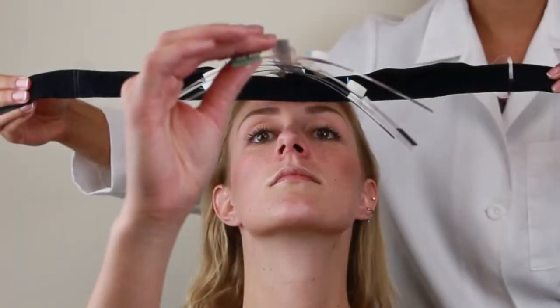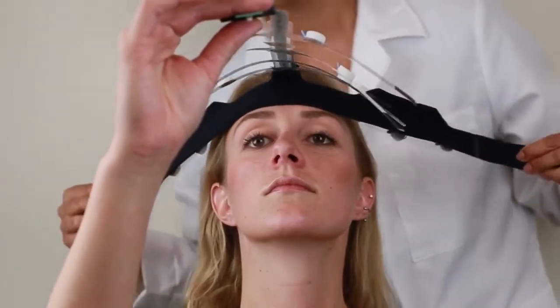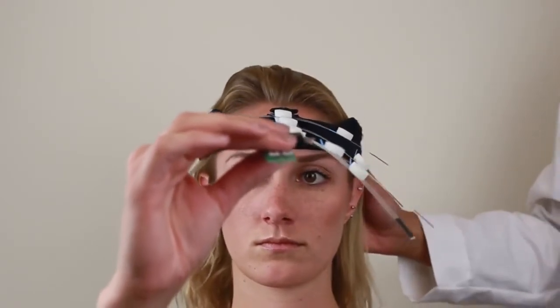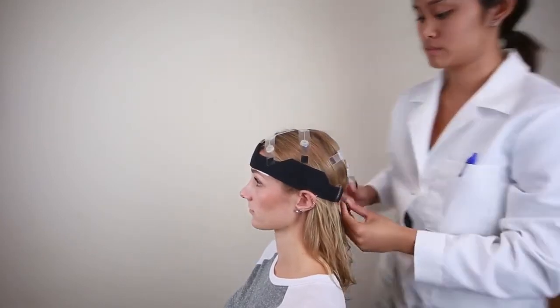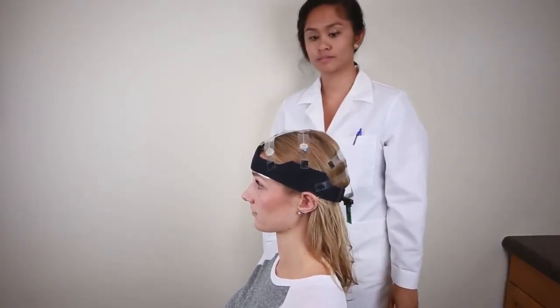While standing behind the participant, ask them to lean their head slightly backwards. Place the strip and strap on the participant's head just above the brow bone, aligning the triangular piece of the neoprene strap with the participant's nasion. While holding both sides of the neoprene strap, ask the participant to gently hold the connector in front of his or her face while you fasten the strap behind the circumference of the participant's head. After tightening it to a comfortable and snug fit, check both sides to ensure the strap sits just above the top of the participant's ears. Double check that the triangular tab is centered to the participant's nasion. Next, take the green strip connector from the participant and bring it up and over the top of the participant's head. Lightly fasten the two furthest back strip tabs down onto the strap at the same time. This will keep the strip in place while you add more cream to the sensor's scalp sites for each of the temporal sensors. It is now a good time to ask the participant if the fit is comfortable.